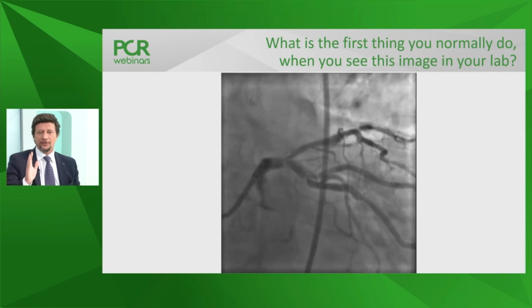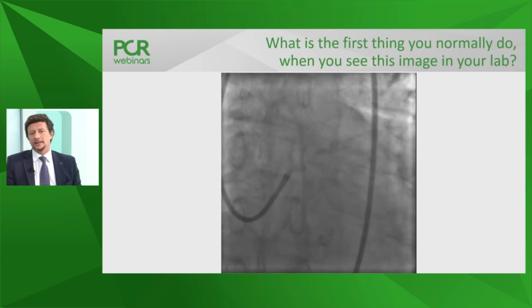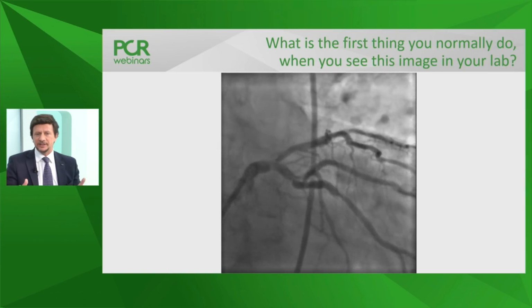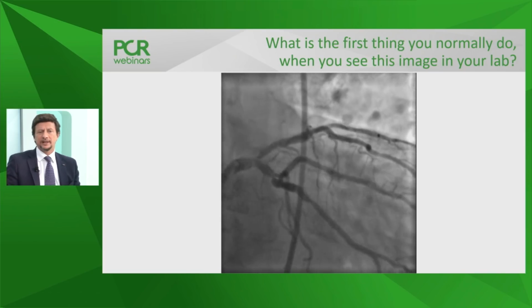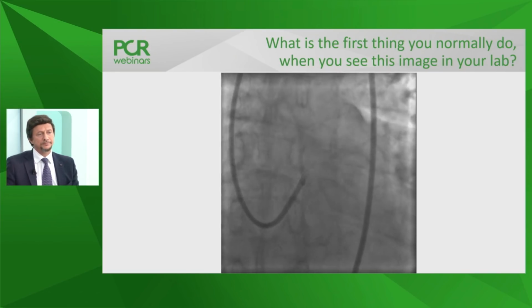But my first thought in a case like this, with these nice distal vessels and such a complex, tight and calcified left main, is about surgery. That's actually a very good point. Both of you shared important points.